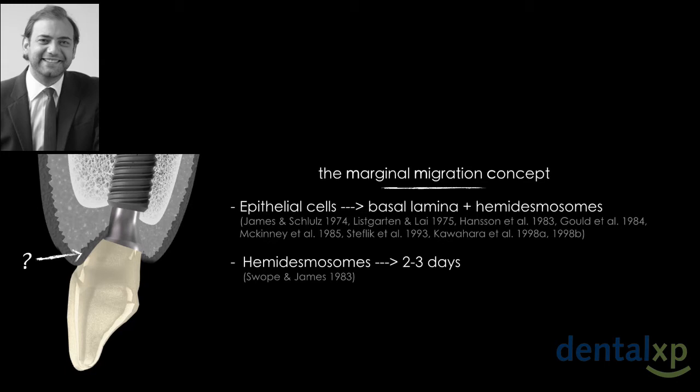It will never work, and we will see a case later on, when we're dealing with thin tissue and we do not like to graft soft tissue, for several reasons. One of the reasons I do not, and I minimized soft tissue surgery after I went back in Greece, is smoking. Everybody's smoking in Greece. So periodontal surgery in smokers is not really predictable, and we would like to be predictable.